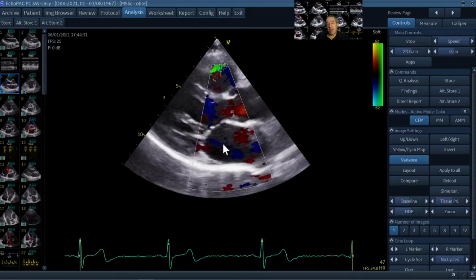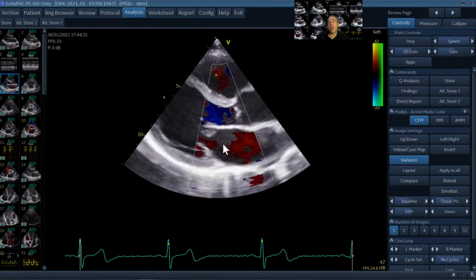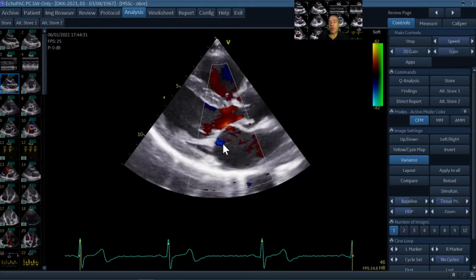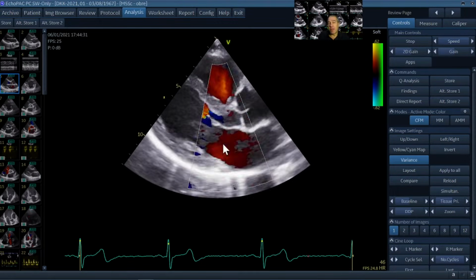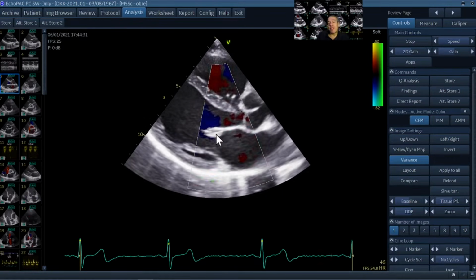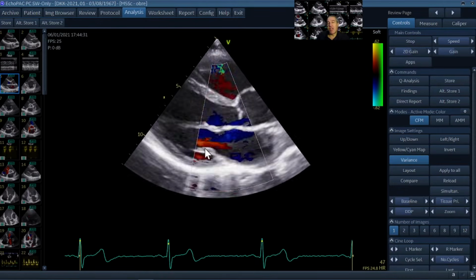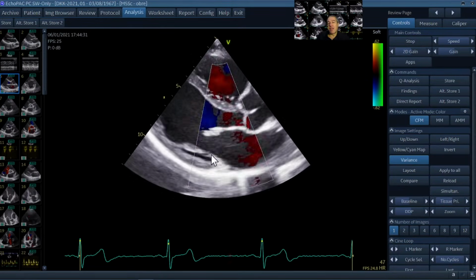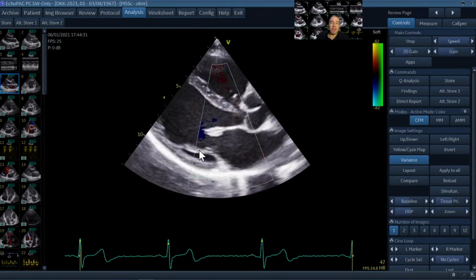If you do the color Doppler during the exam, I would recommend to always tilt the probe in the other axis, so more to the right and left, so as to scan a little bit for regurgitation at the extreme borders at the side of the valves.